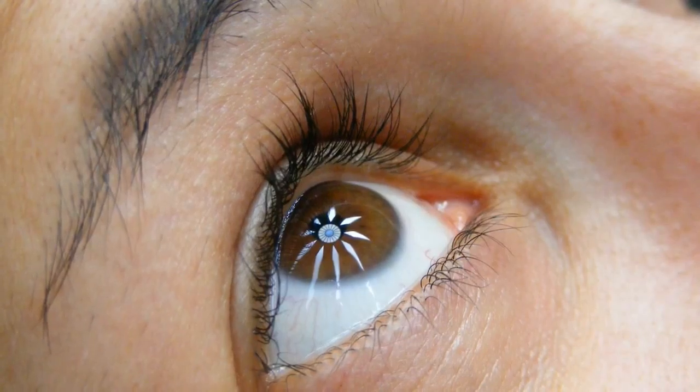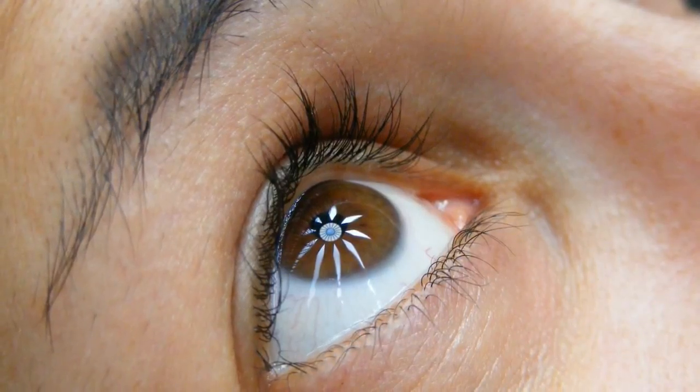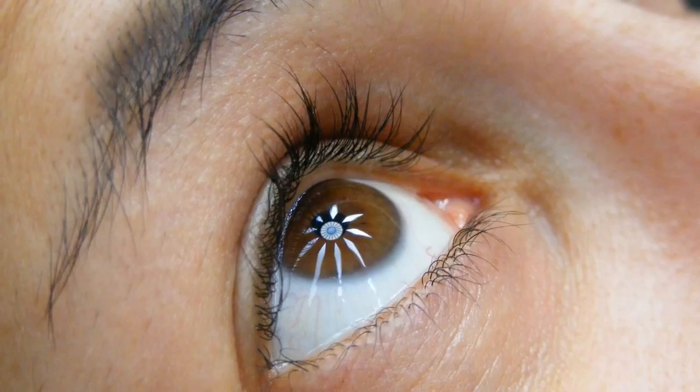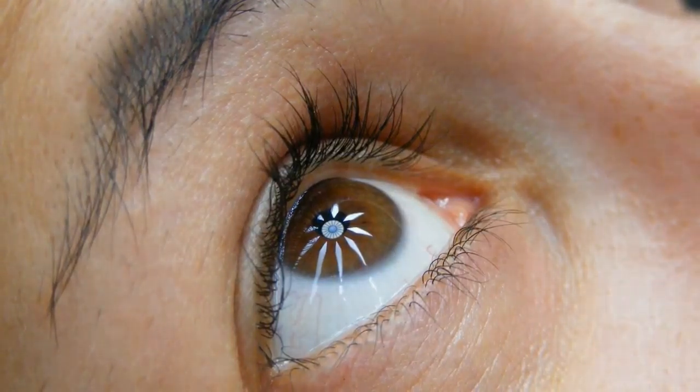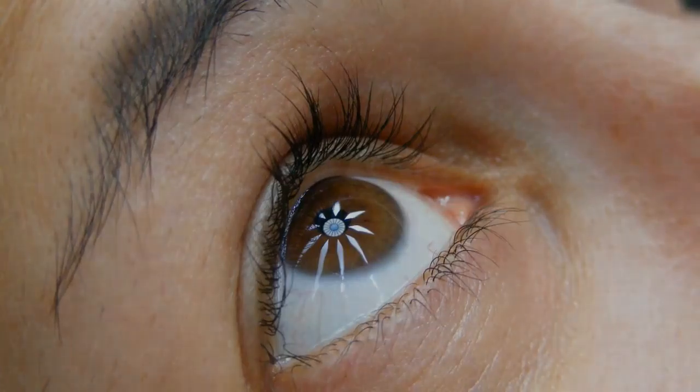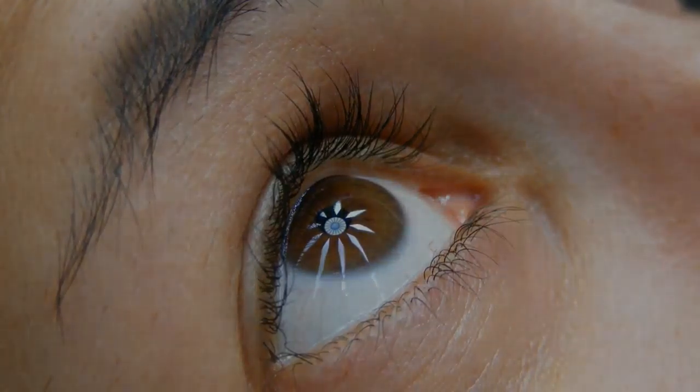The 10-minute procedure is suitable for those with intermediate-stage and advanced AMD. And in another first, it is also suitable for those who have had a lens replacement due to cataracts, which was previously impossible.